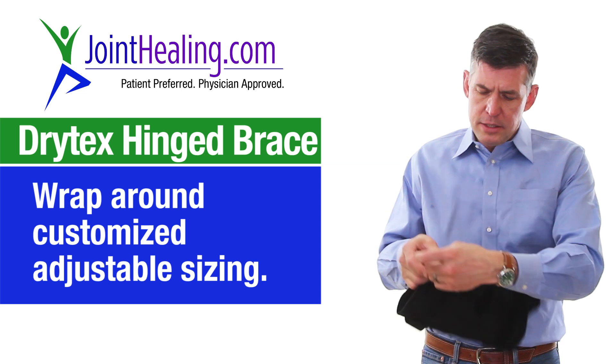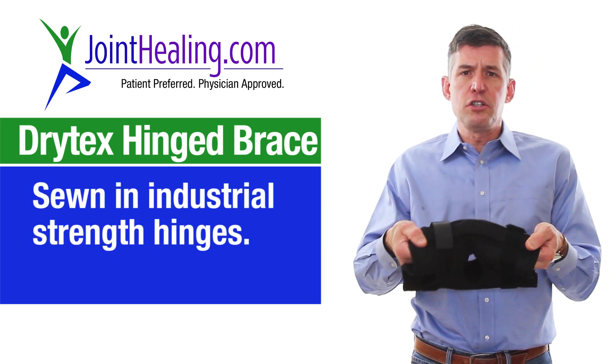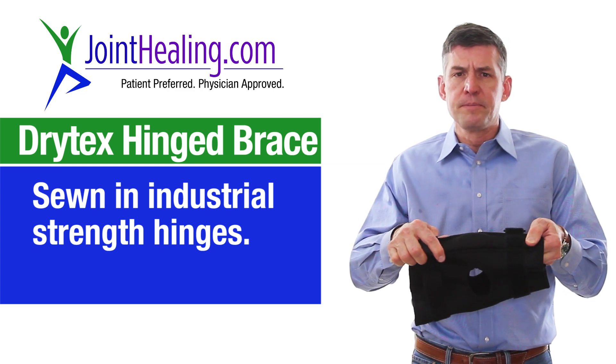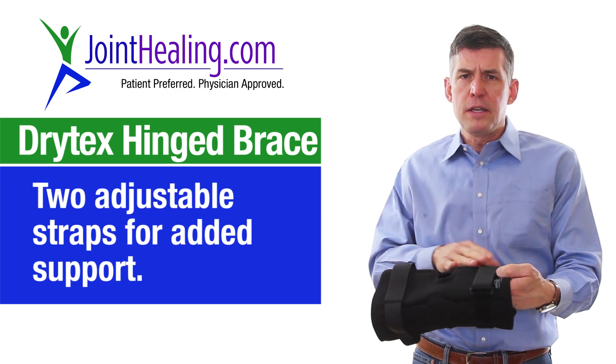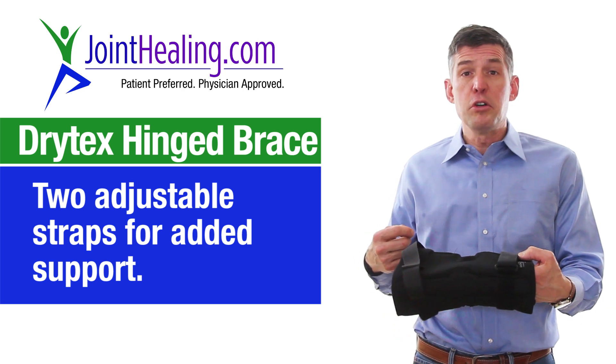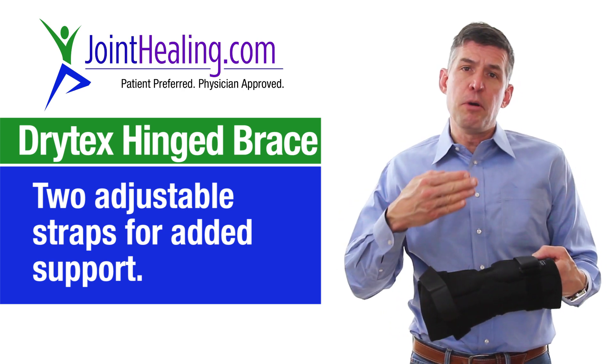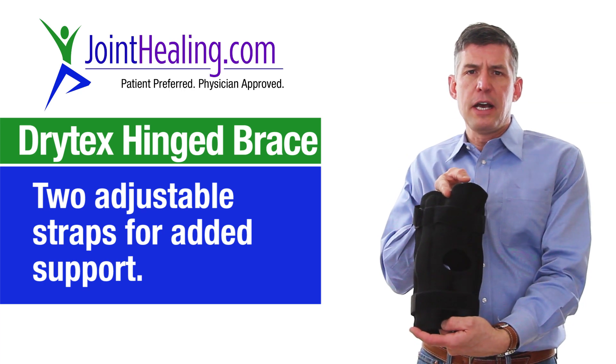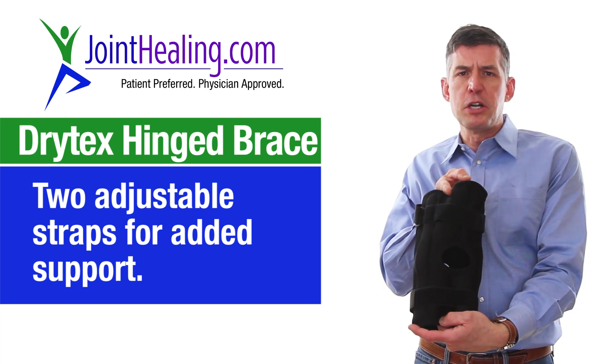It also has two industrial strength hinges that are sewn into this to help prevent hyperextension. There are two straps over the front that help give you a little bit more stability in what's called the anterior-posterior plane. And in the back, there's a little cutout for that back part of your knee that always gets bunched up.